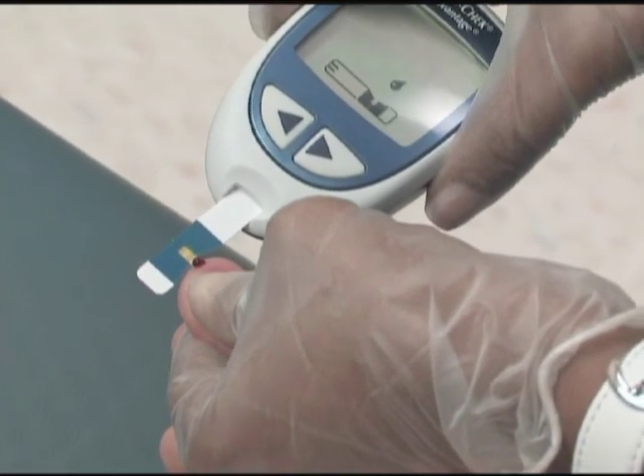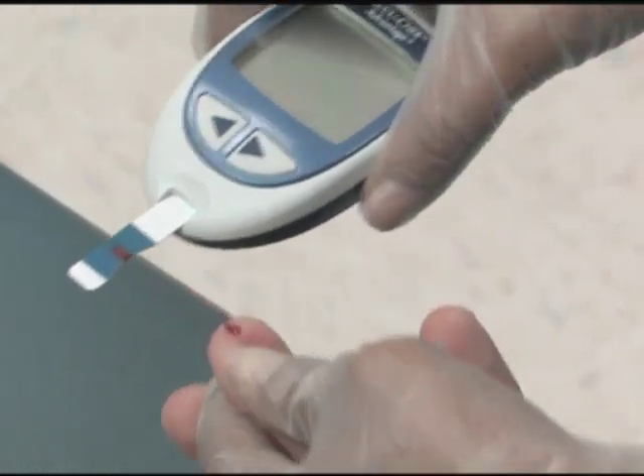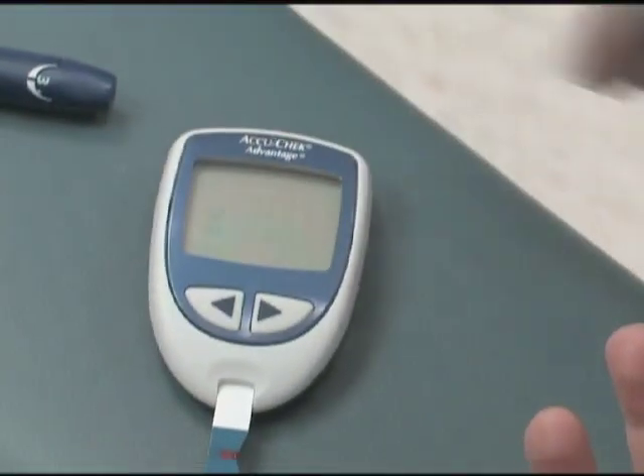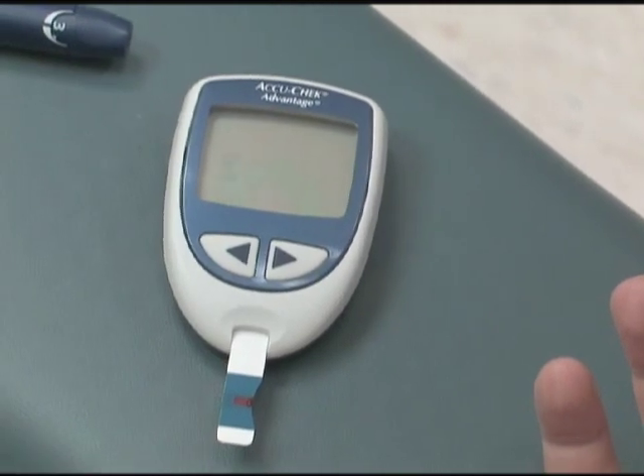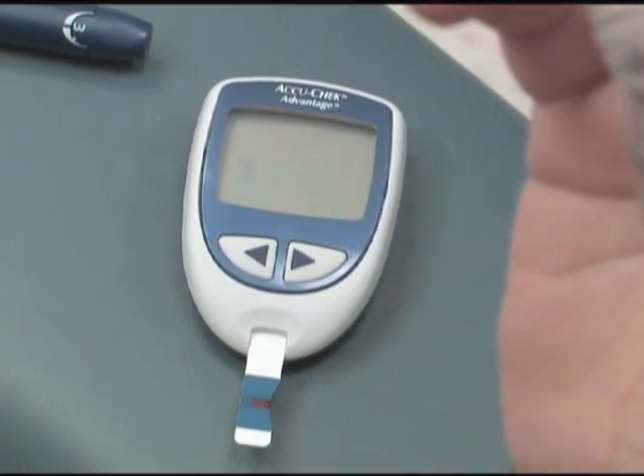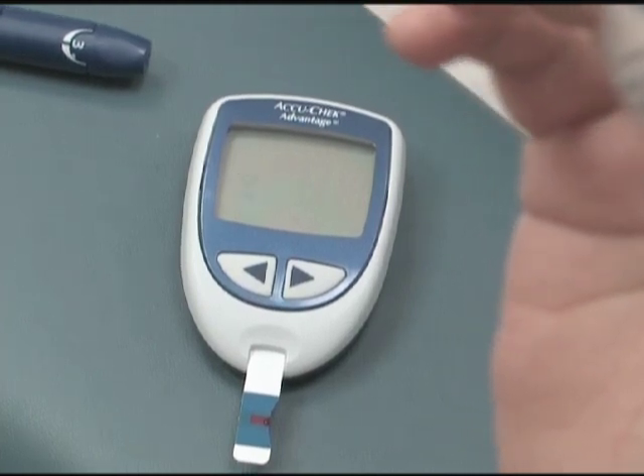Touch the edge of the test strip to the drop of blood. The blood will be pulled into the strip. Fill the target area of the strip completely. Do not let the strip touch the patient's skin when you obtain the specimen, because oils from the skin may affect the test results.